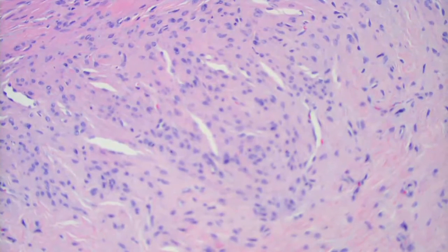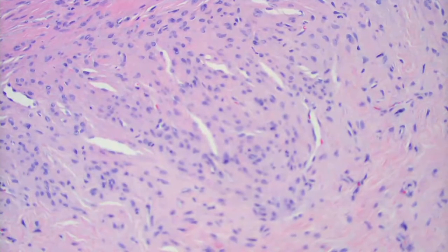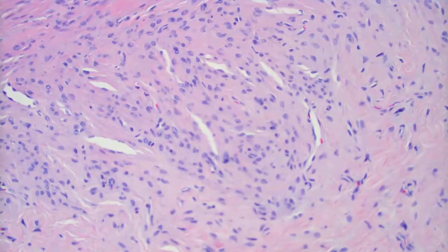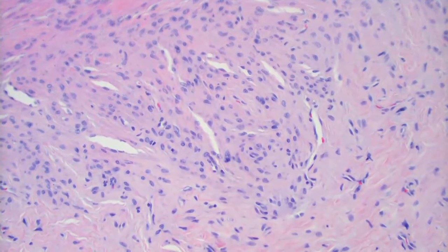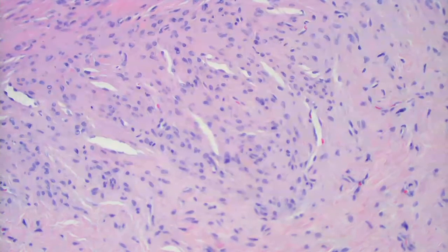So this is what they look like. They can look like an acquired digital fibrokeratoma or like a poroma or some kind of non-specific lesion when you look at them clinically. And then if you see this on the biopsy, it's really characteristic. You get this little whorling, storiform pattern quite common, the onion skinning around the structures. Why is this S100 negative? Because it's not really Schwannian in nature. It's not the actual nerve. This is the lining structure around the nerve. It's an epithelium in a way.